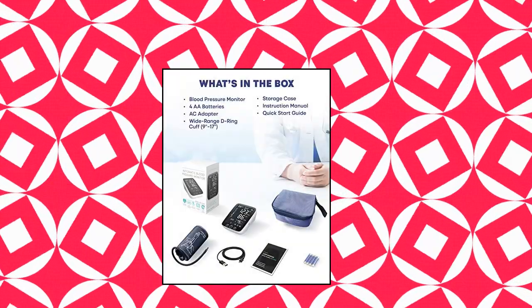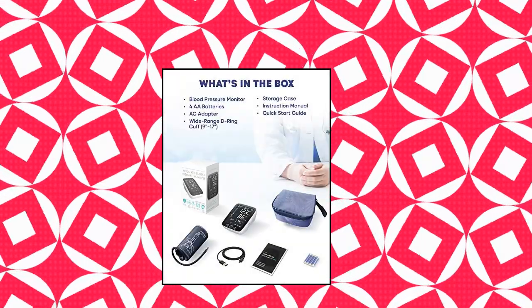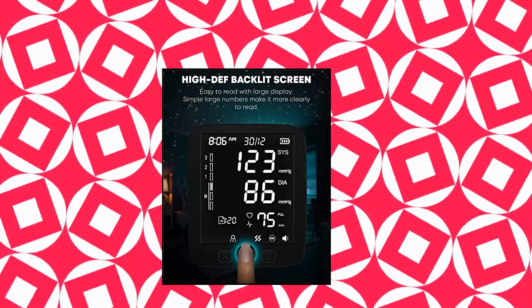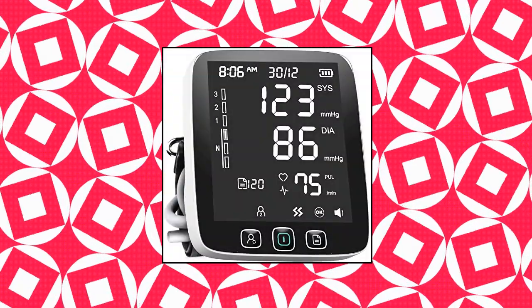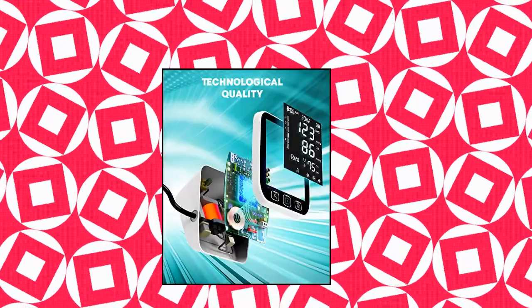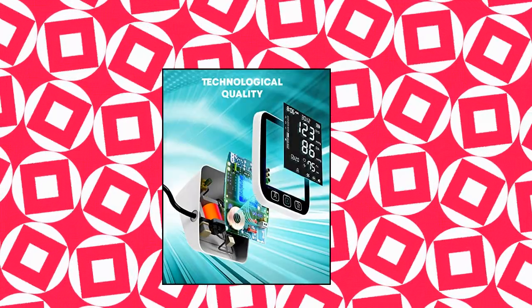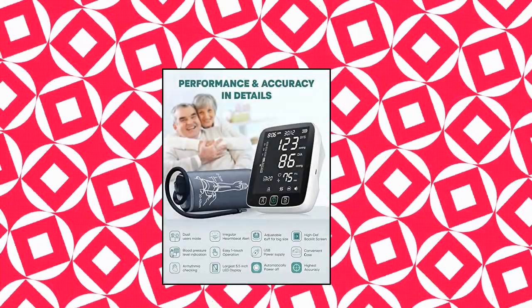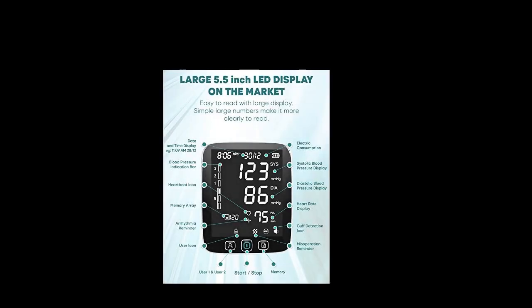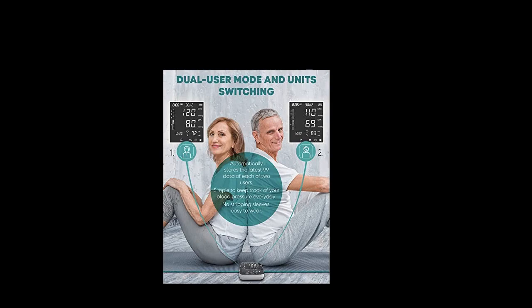All new LAZLE Blood Pressure Monitor — automatic upper arm machine, accurate adjustable digital BP cuff kit. Largest backlit display, 200 sets memory, includes batteries and carrying case. Top brand recommendation by doctors and pharmacists. Their blood pressure monitor with a large LED screen gives you a great visual experience, making readings clearer so users can view results more quickly. Clear large fonts and high-definition backlit screen offers clear reading at nighttime for an advanced measurement experience.